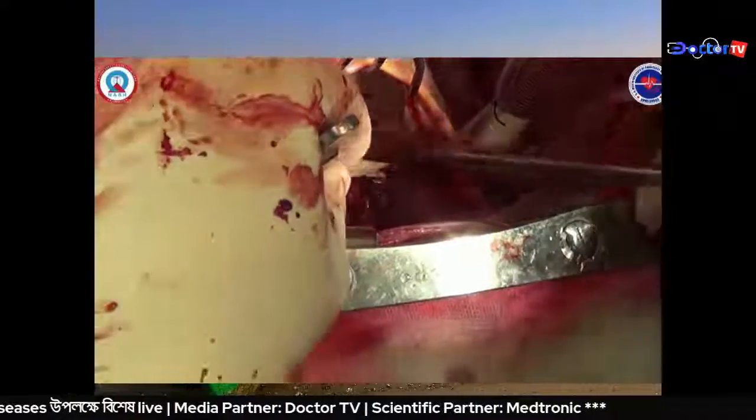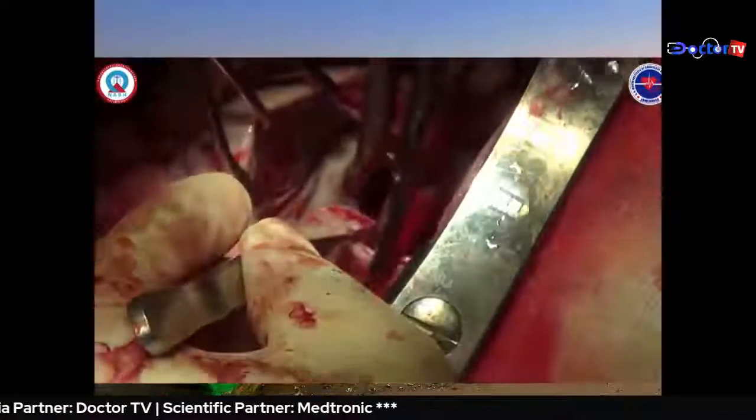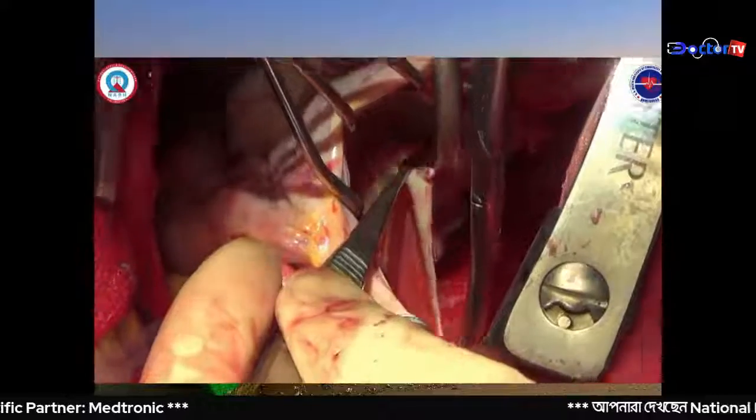Here you have to be careful about the circumflex, 5 millimeters away from the circumflex. So this is the incision which I have extended and divided the right and left pulmonary cuffs separately. Now I am assessing the posterior wall and the superior and inferior wall as to how much I have to excise, how much room is there. Remember, there shouldn't be too much tension when you are suturing them back together. When you extend the paraseptal incision inferiorly, there is the coronary sinus just nearby, so you have to be careful about that also. Here I'm excising the posterior wall, assessing how much I can take out.